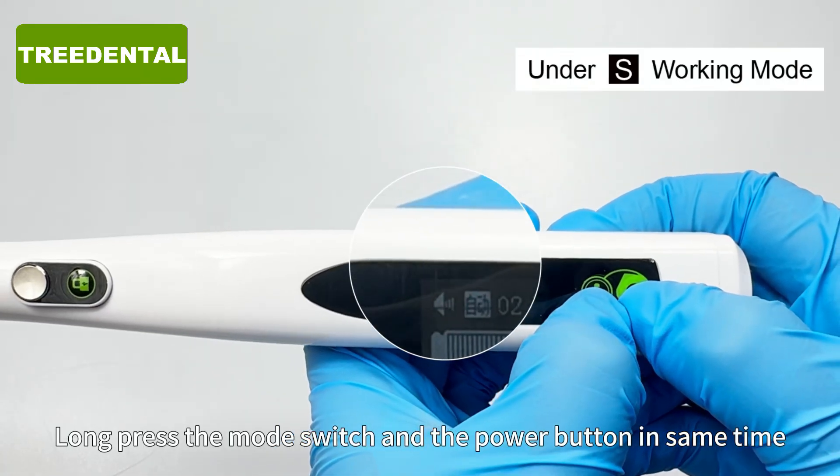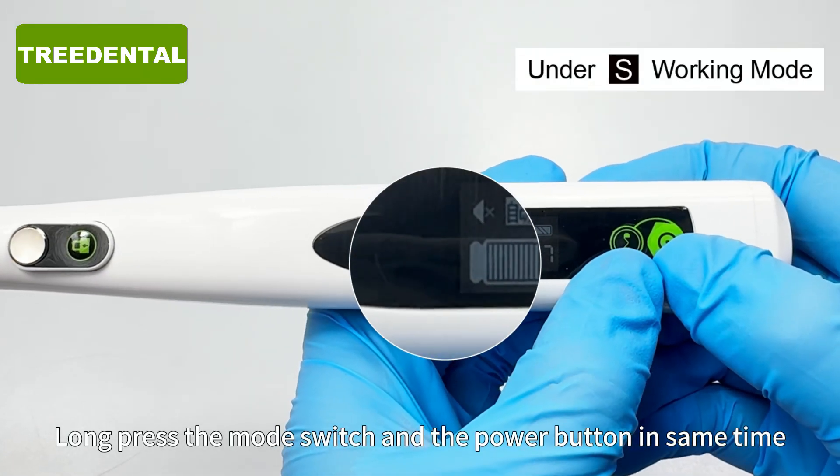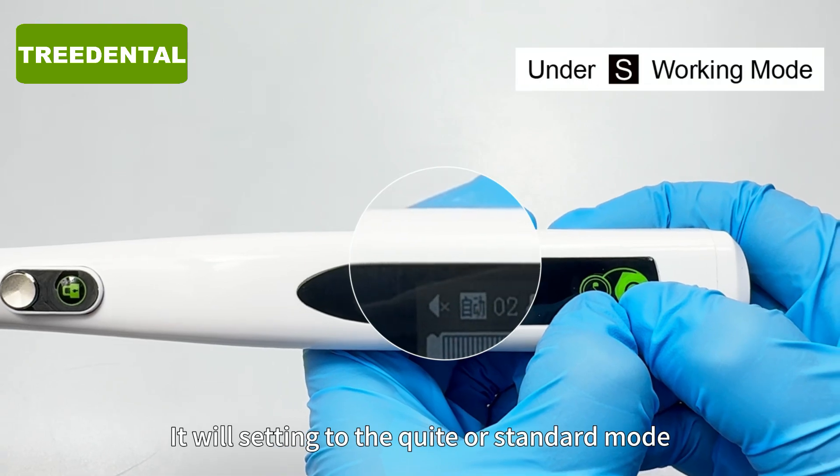Long press the mode switch and the power button at the same time. It will set into the quiet or standard mode.